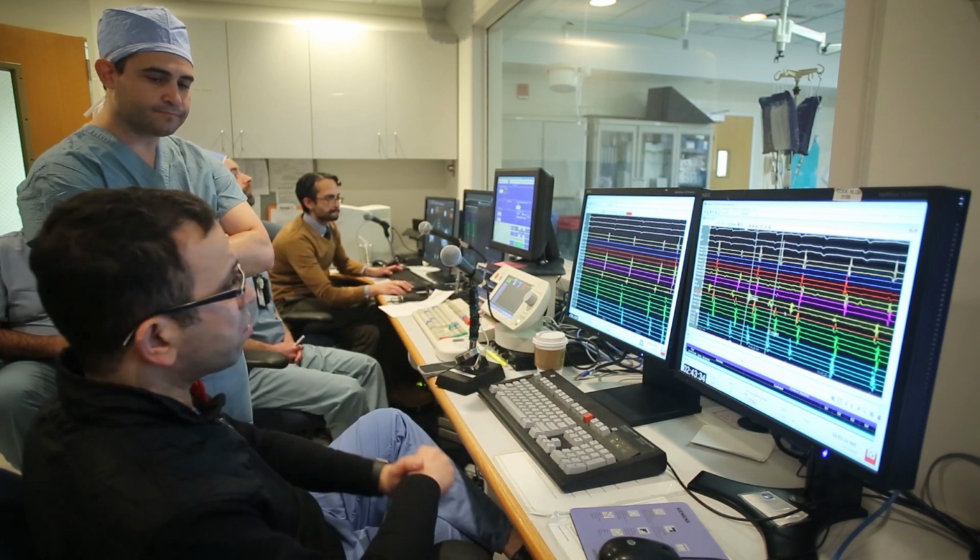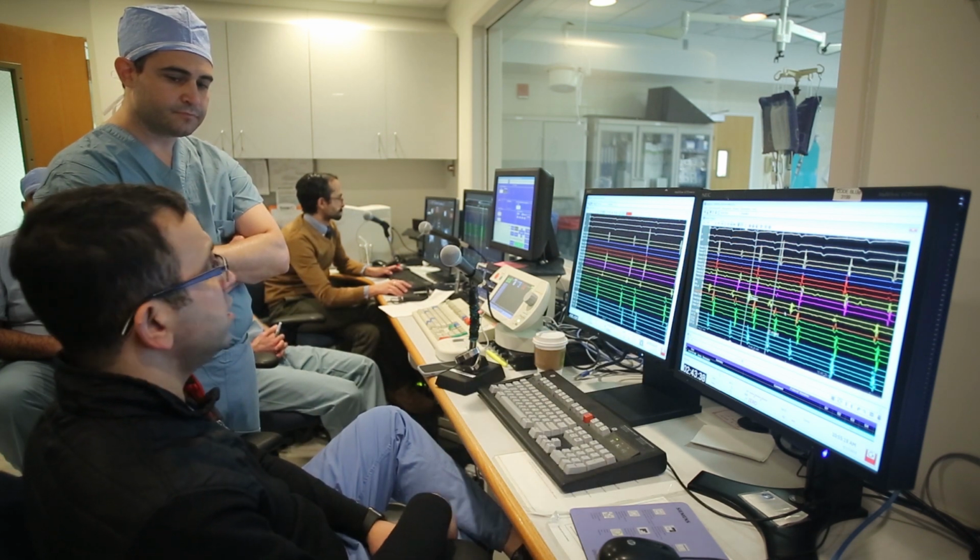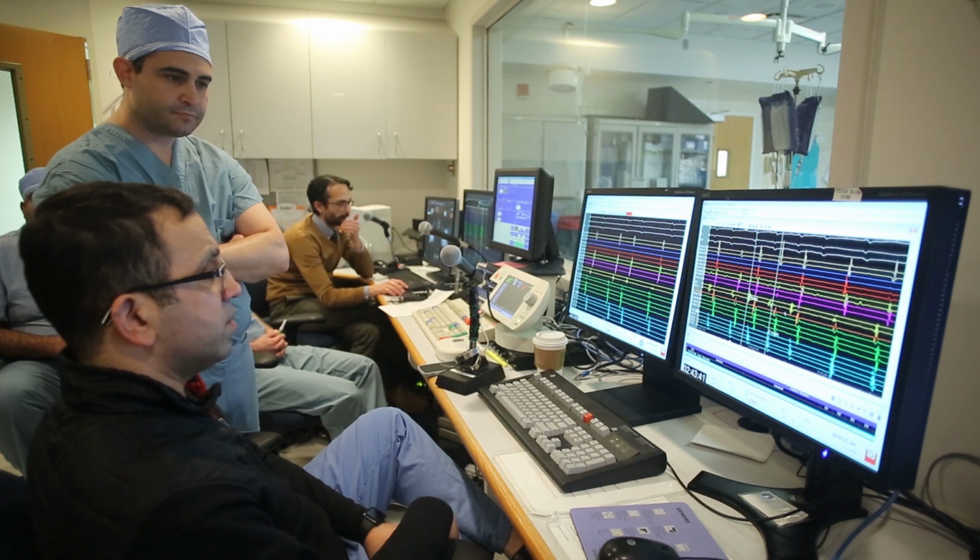Yeah, and it's actually not very difficult. As long as you nail down and you bracketed this area, it's pretty straightforward.